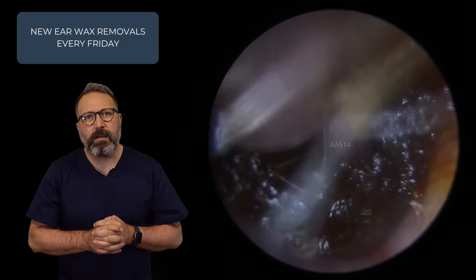My voice is going again. Out that's come — I've dropped it into the bowl of the ear. Let's pick it up with the Jobson Horn, just so you can see what's come away. Those lighter material bits underneath are a little bit of dry skin. So we'll take a look behind — a whole plug came away, but we've got this sheet of dead skin at the base of the canal, so let's take that away. Out that pops. You can see it was quite a flat sheet of skin at the base of the canal. Skin is meant to migrate out towards the outer part of the ear canal and then just break away and come out with wax — but in this particular case it had stayed stuck to the canal wall. I'll just hoover that bit up and we'll take a look behind.